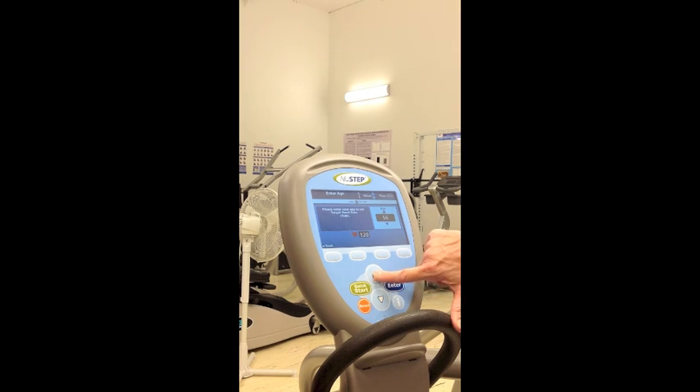Now we come to Age. Depending on the participant's age, either use the up or down arrow to reach the desired age and then push Enter. Because we want the participant to at least try to reach 85% of their age-predicted heart rate max, you can use the up arrow until you reach that 85%, and then push Enter. Now we see Weight — use the up or down arrow until you get to the desired weight, and then push Enter. You go back to this main menu and now you are ready to begin.